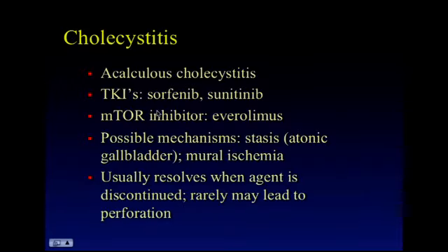All right, now I'd like to turn our attention to cholecystitis and the unique manifestations that patients undergoing chemotherapy can manifest. And this, we think, is an acalculous cholecystitis. So generally they don't have stones.